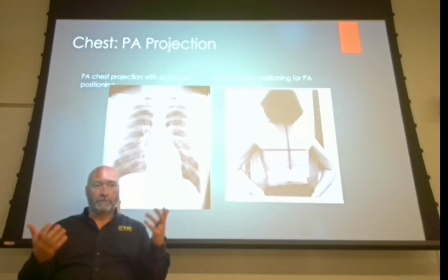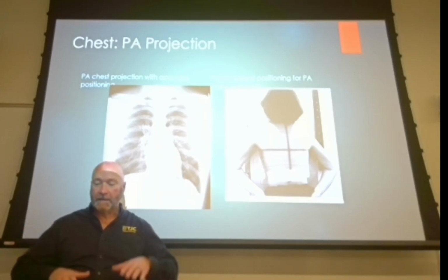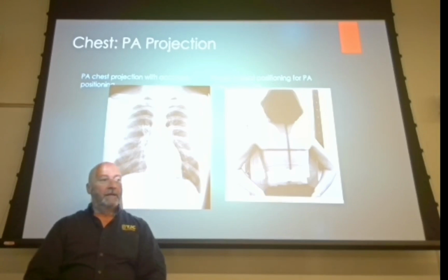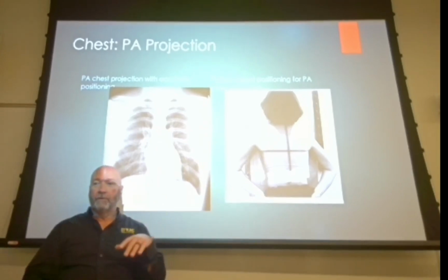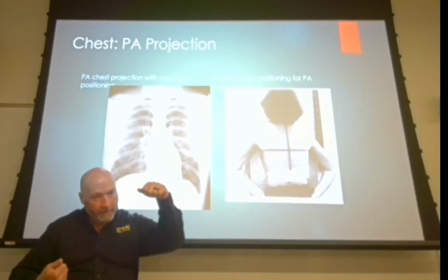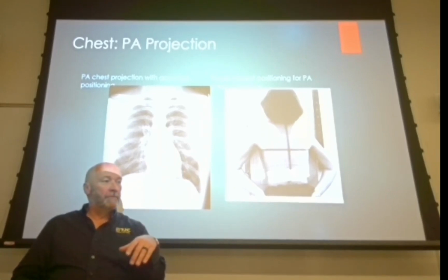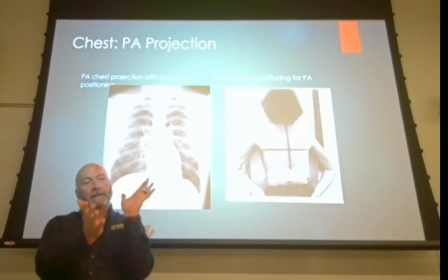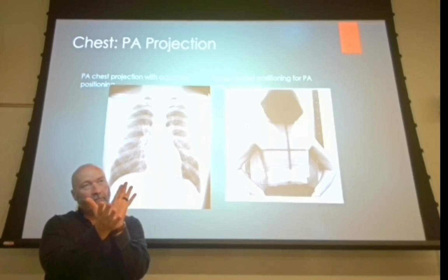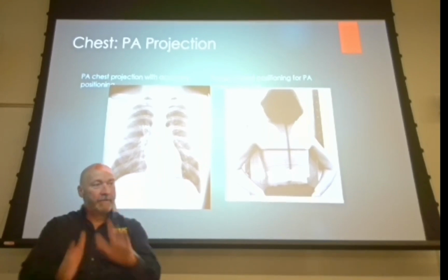So what you want to do, let me finish that thought. You've got this patient sitting there, the legs straight out in front of them, and you try to sit them up almost to a 90-degree angle, and then you want to pull them forward and put the image receptor behind them. So they're already uncomfortable, and with their flexibility, they're probably as bent as they can possibly go.